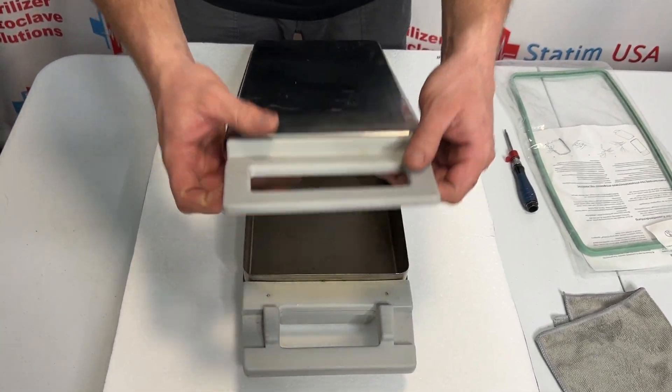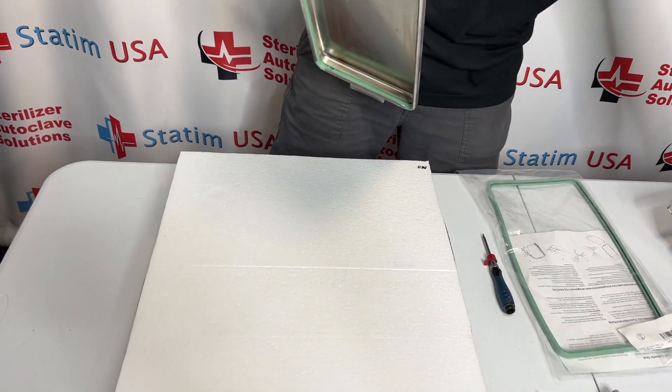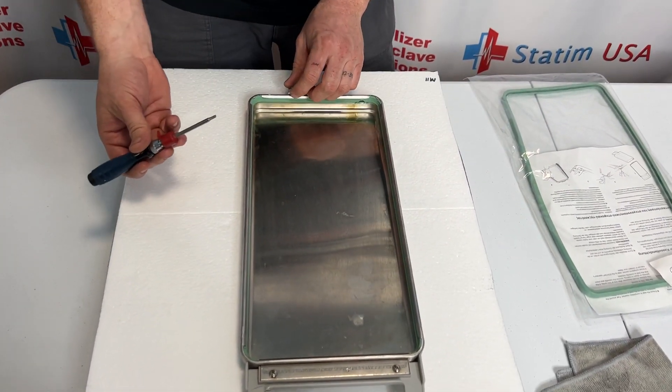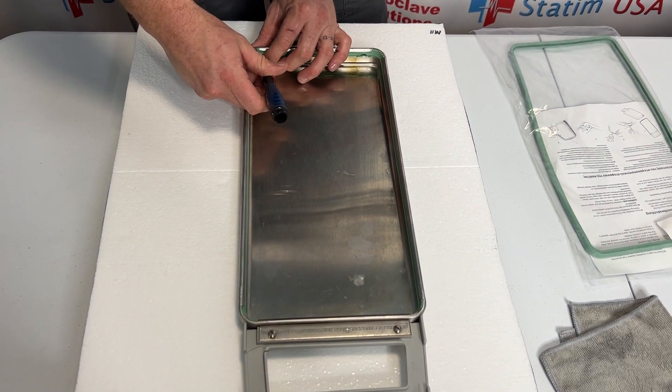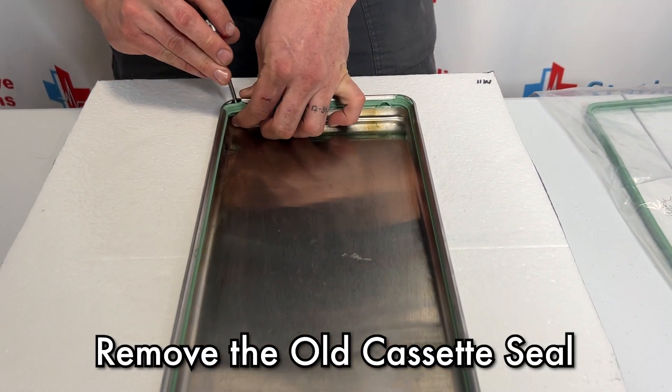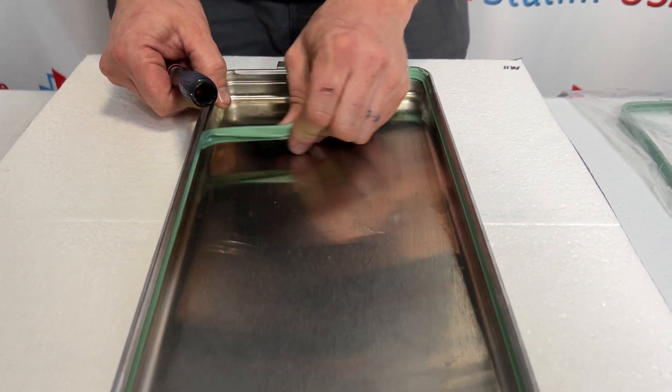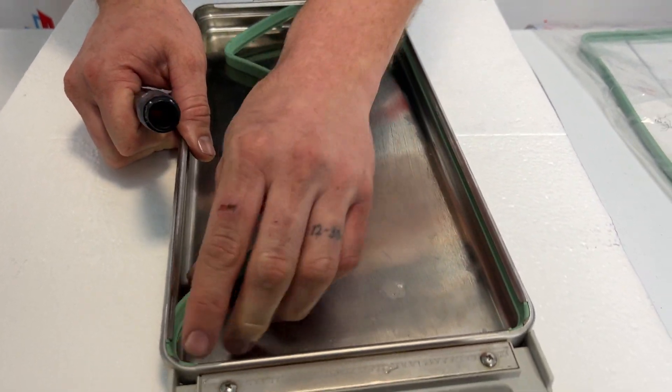First thing I'm going to do is separate the top from the bottom. I'm going to set the bottom to the side. With that on its back, I'm going to use a flathead screwdriver and I'm just going to get behind one of the corners and kind of pry that out. Once I have that pried out, the rest of that seal should pull out.